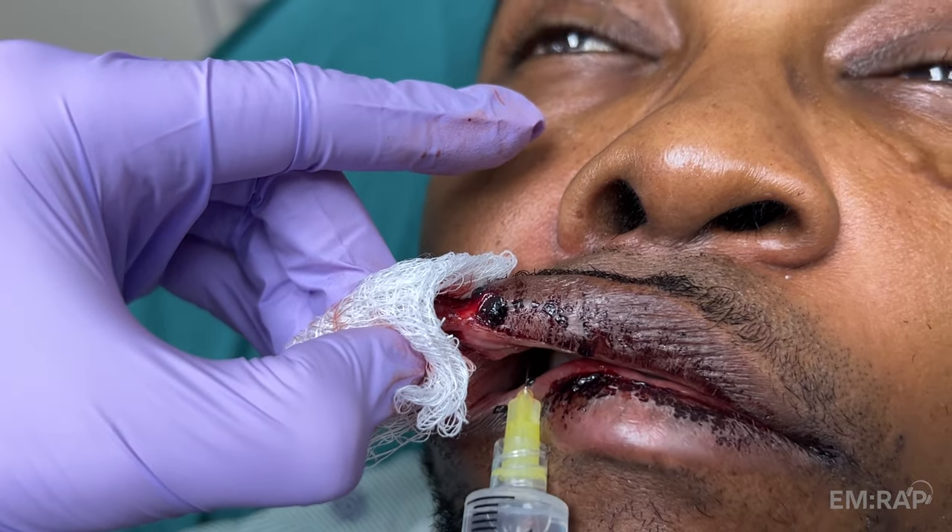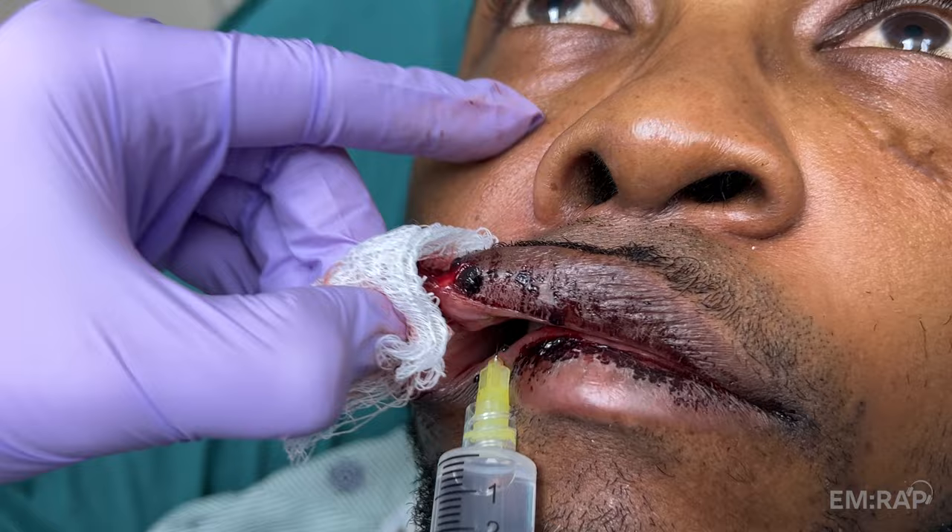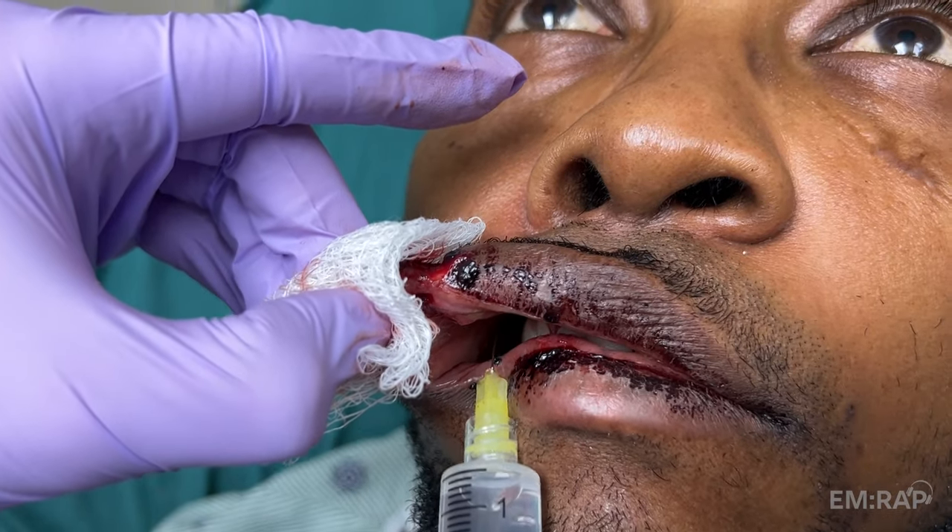If you're very careful to not poke yourself, you can place a finger over the foramen to feel the anesthetic infiltrate and prevent it from going into the lower eyelid with some gentle pressure.